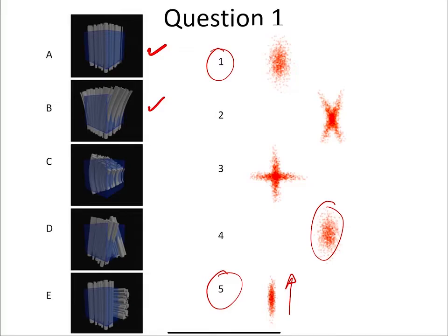In that case, it's a little hard to tell, because over that voxel, this is like bending fibers, right? And this is fanning fibers, and this is bending fibers. But you can see that over the course of a voxel, if I split that in half, I could take this bend and put it up there, and it'd be a fanning. So it's going to give very similar results. And there's a lot of that happening in the brain.